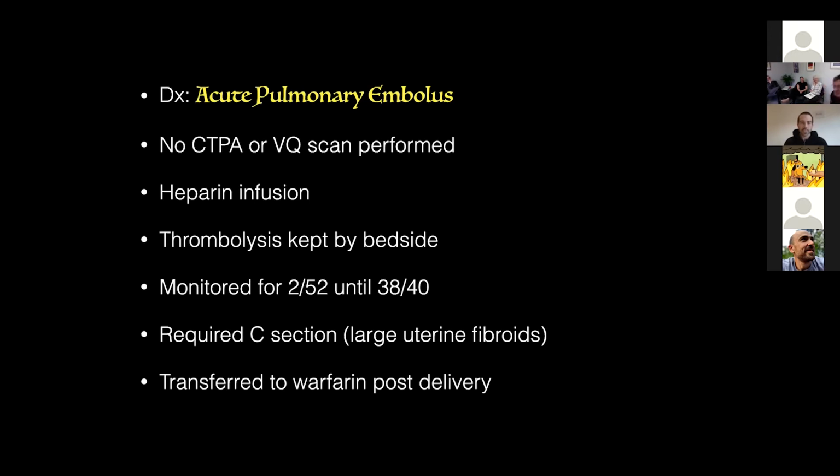So the point to be made is that it was the echocardiogram that really ran the whole thing. And at least we think now she got out of hospital with a healthy baby. She hasn't got an increased risk of breast cancer. We didn't have to deliver radioactive therapy to the baby. I'm just going to add that she's also got a 60-60 sign, probably being pretty useful there as well.